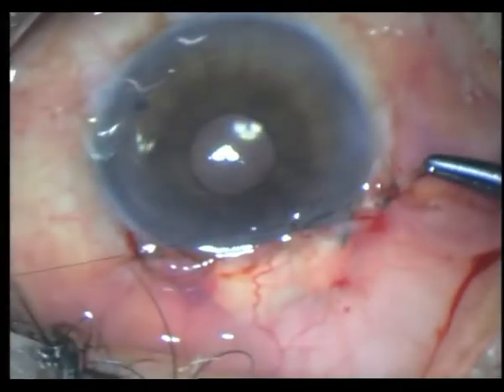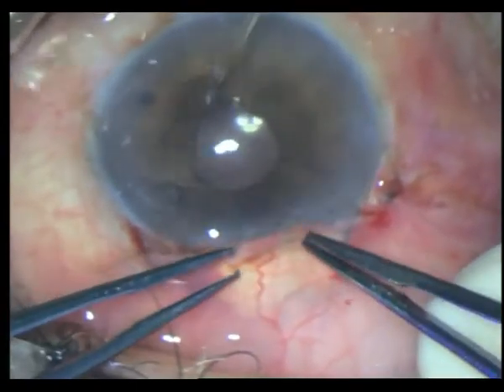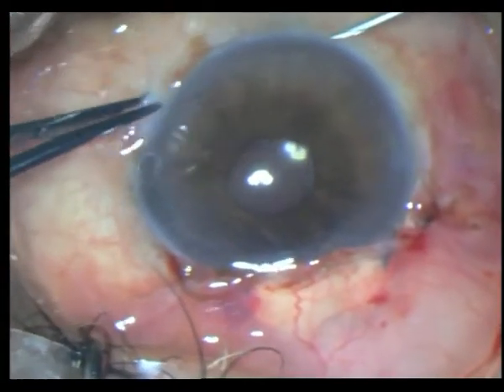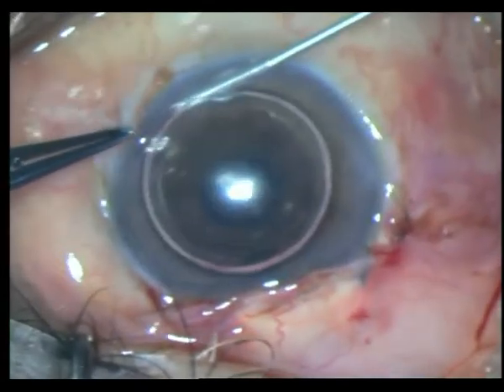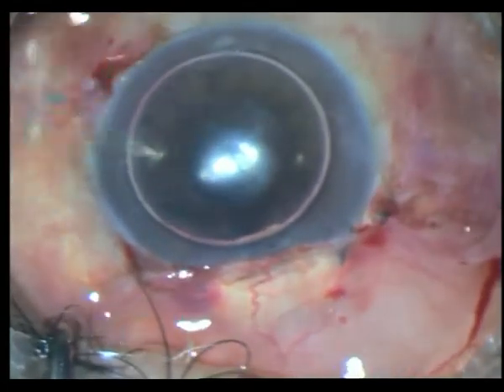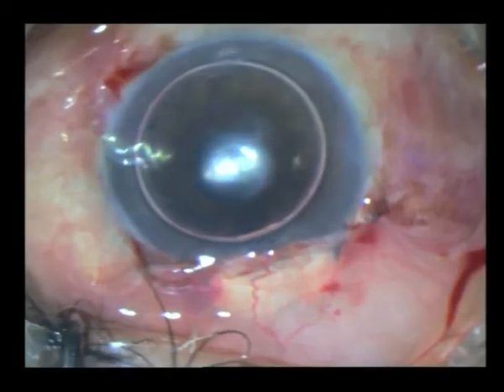This is the closing step of the first part of the surgery — putting in an air bubble. The repair actually worked very well, but about two weeks later it worked too well and the pressure went up into the forties, which became a problem again.